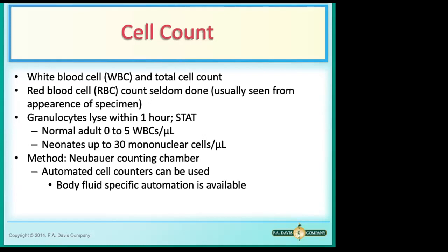Microscopically, we use a method called the Neubauer counting chamber method. That's a routine process that we perform to count the cells in the cerebrospinal fluid, okay?